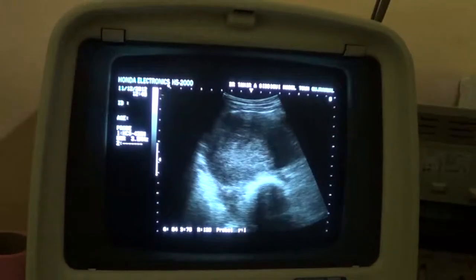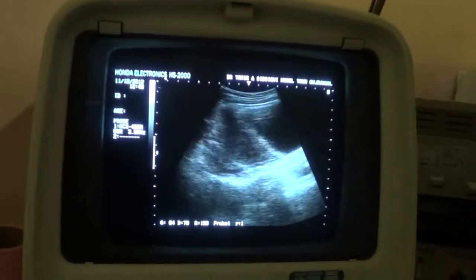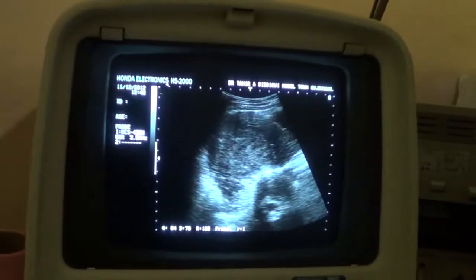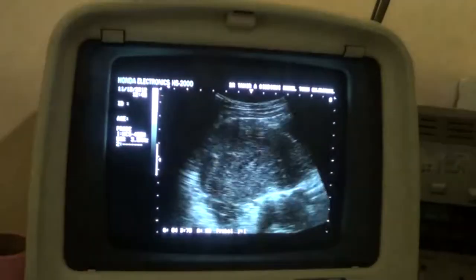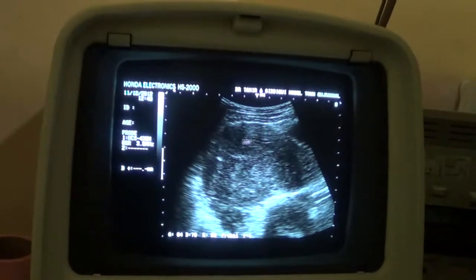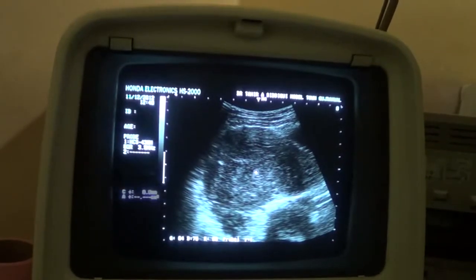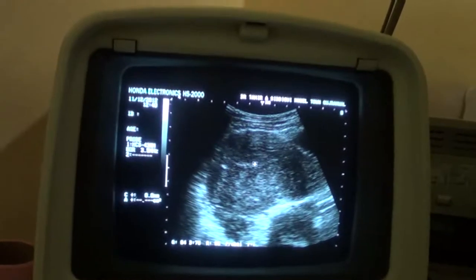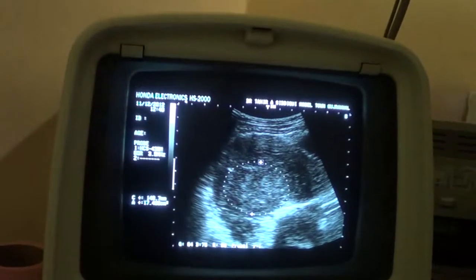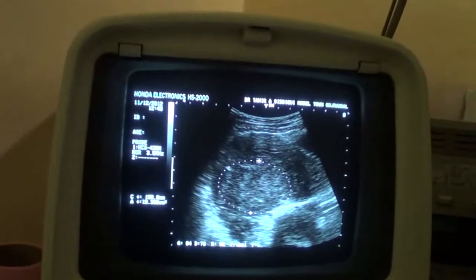This was the longitudinal section, and this is the transverse section, in which again you can see that the fibroid is elevating the uterus. This is the endometrial canal. This is the anterior myometrium, and this is the fibroid in transverse section in the posterior wall of the uterus. It's a large fibroid, whirly appearance, inhomogeneous rather.